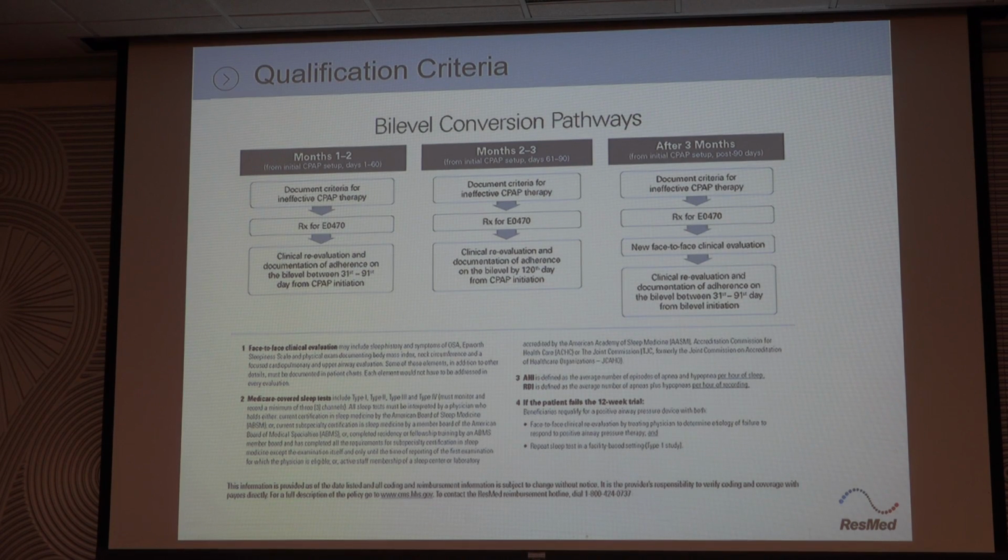So as a manufacturer, our goal is to make it more efficient. What costs the most about providing CPAP? It's probably not the cost of the machine, it's the labor involved, hopefully a therapist involved. If we can make that a lot more economical, you can sit in the office to find these patients and see what they're doing. That's a lot smarter, and then you can actually survive on the reimbursement. So that's with an OSA diagnosis.